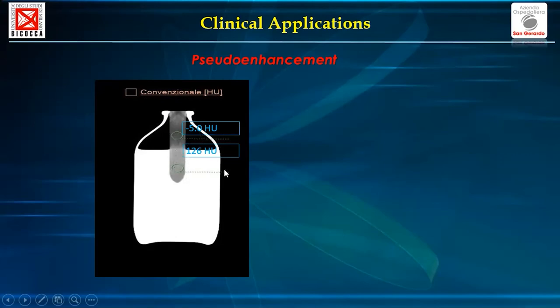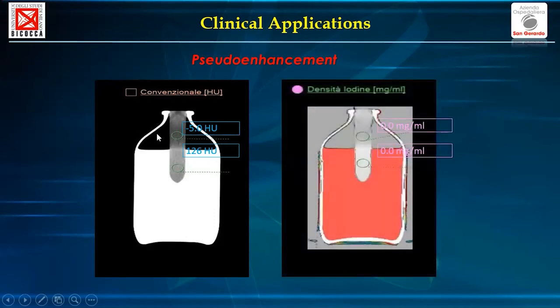And the part of the water that is surrounded by contrast agent presents really high attenuation values, while the same water surrounded by air presents a negative value. But if we reanalyze the same images with a spectral approach, no iodine is present inside. So we are more confident in defining it as simple water.